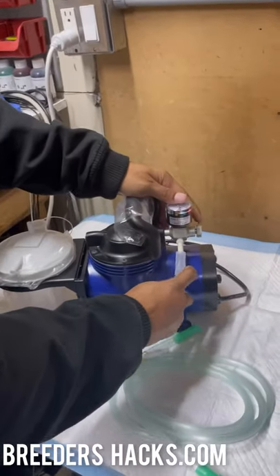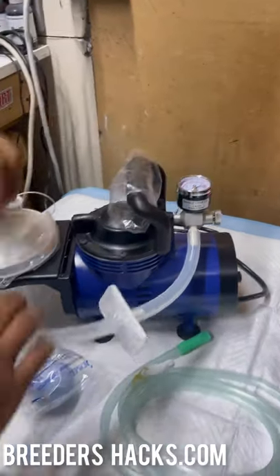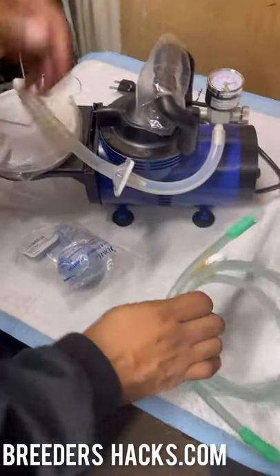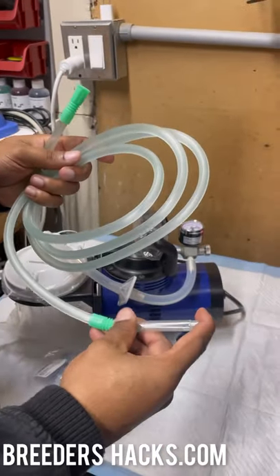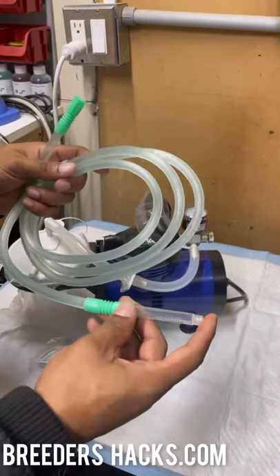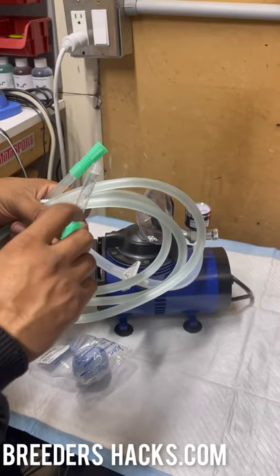What you're going to do is connect the hose that comes in the box to the nozzle right here. Then take the elbow bracket and attach it up top. You'll then use a green hose like this — the hose comes with a syringe that we've retrofitted to fit into it.